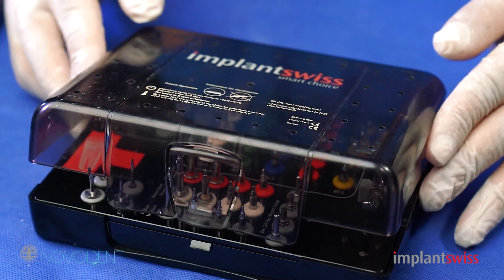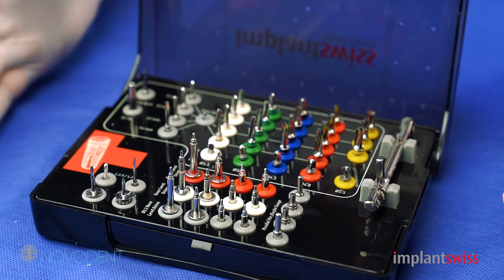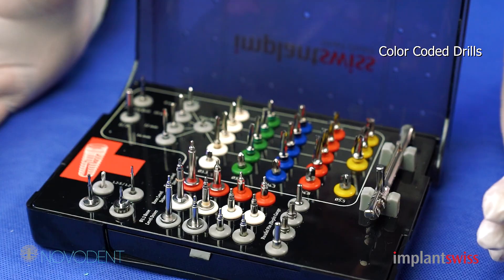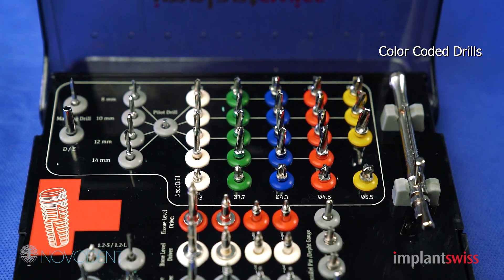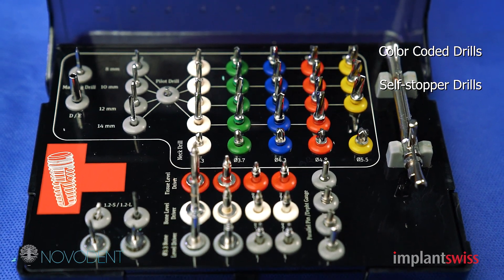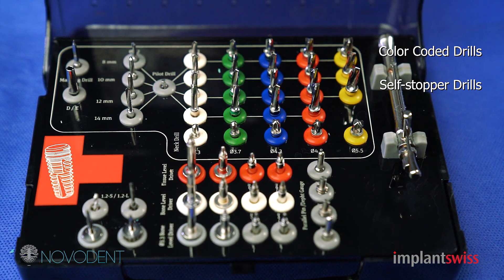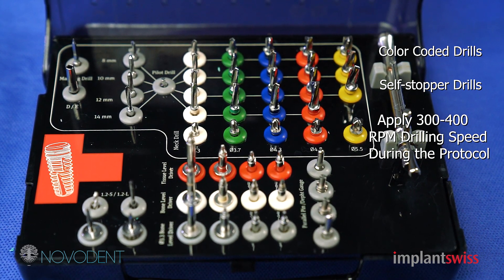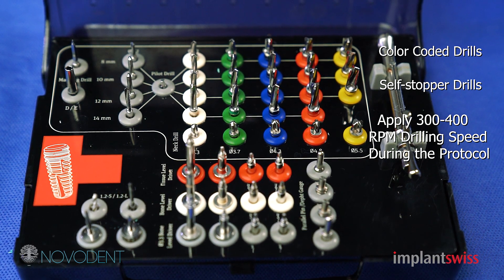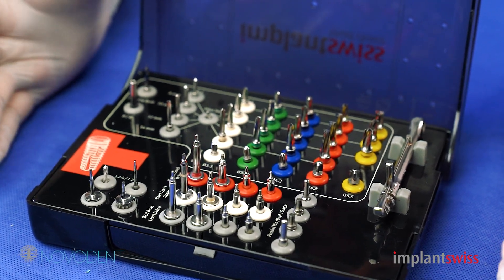This is the surgical kit of the Implant Swiss. As you can see, all the drills you need are arranged nicely with color coding, with one drill for each implant diameter and length, so you have all the safety that you need. You will have all the insertion instruments, whether hand driven or handpiece drilling, and the prosthetic keys, paralleling posts, the ratchet — everything is arranged in a very nice, clean, small surgical kit.